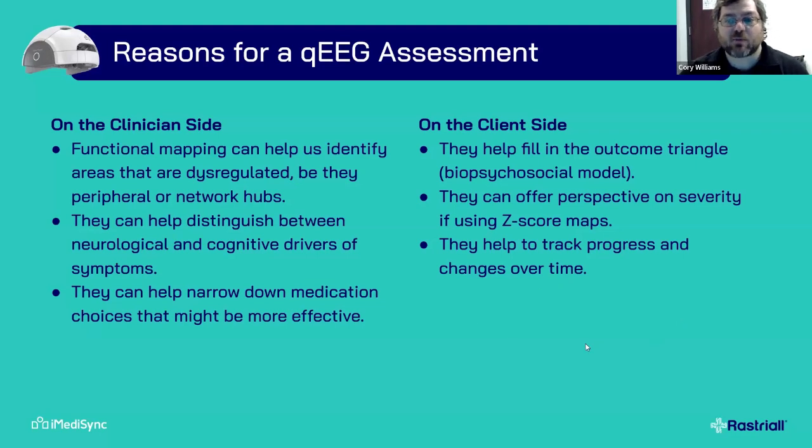And they can help us to track progress and change over time. So if we do an EEG before treatment and an EEG post-treatment, that helps us to measure, hey, look, we recommended this intervention, and you can see very specifically how it helped.